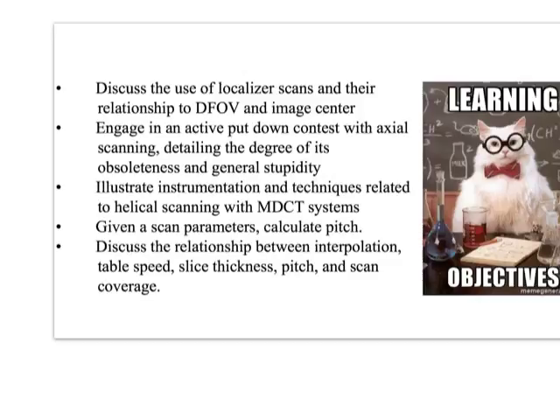We can't actually move where ISO center is, but we can change where the image center is. And then we're going to engage in an active put-down contest with axial scanning, and particularly detailing the degree of its obsoleteness and general stupidity. So if anyone has your mama jokes, this would be a good time to use them, and it's based around axial scanning. Okay, that's where the CAT comes from, right? Computed axial tomography, which really there's no reason for us to be doing any axial work anymore, and we'll talk about why that is. That's why I've made such a strong point on that.